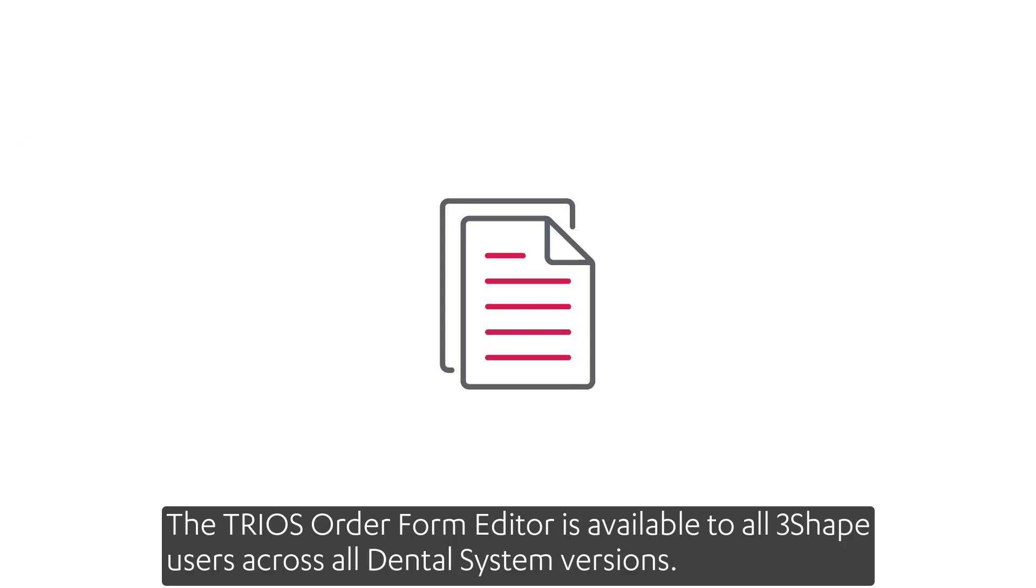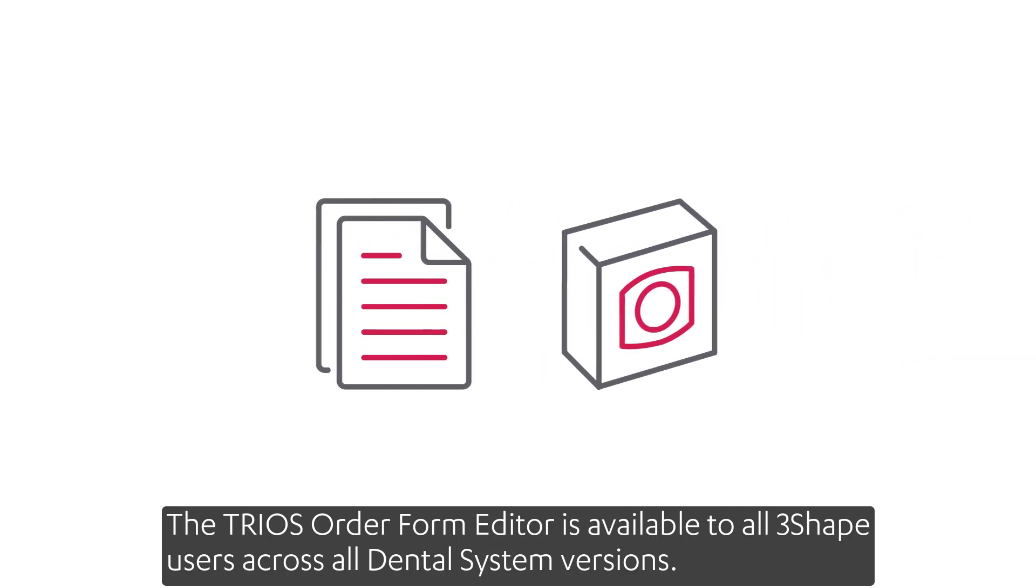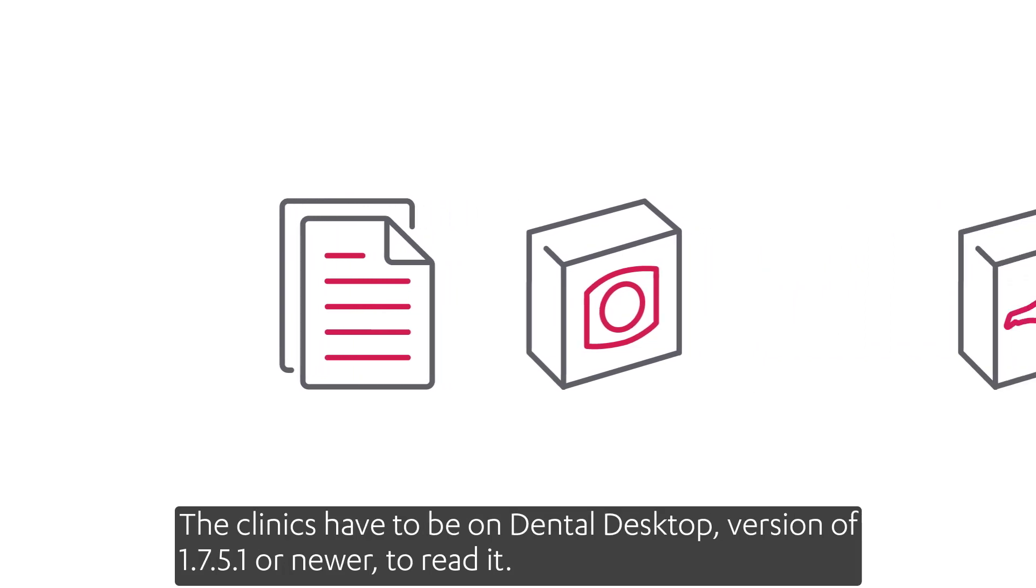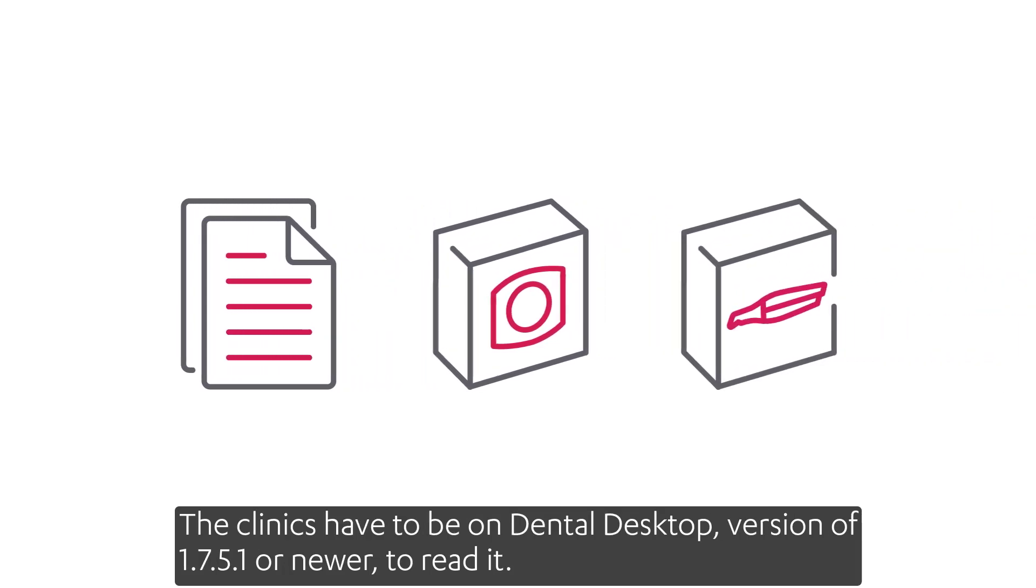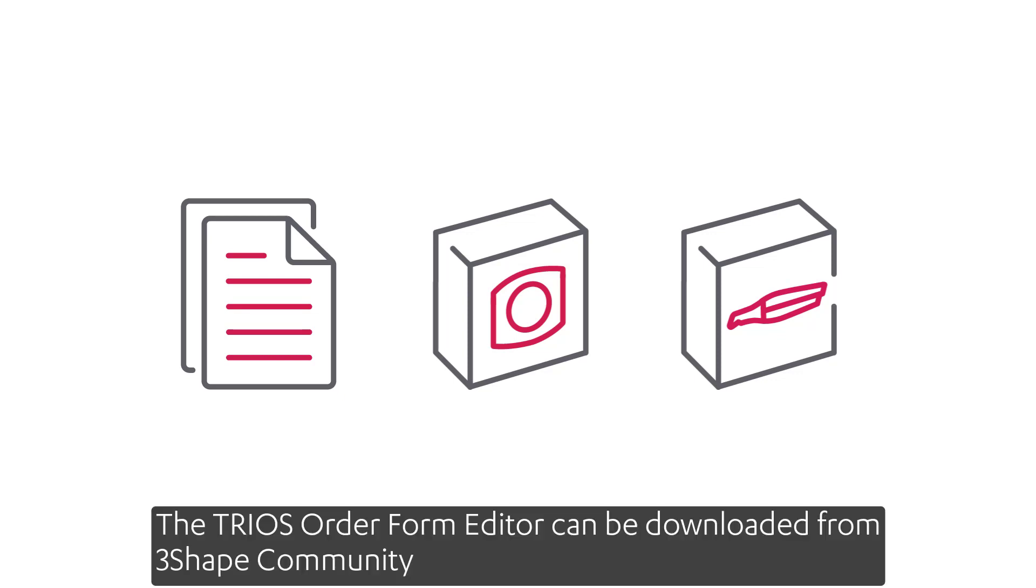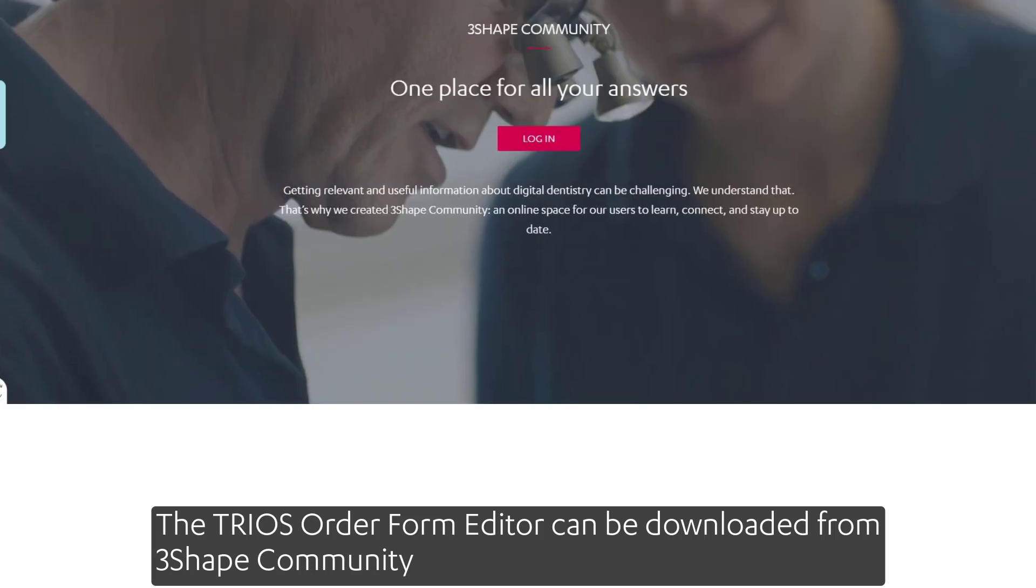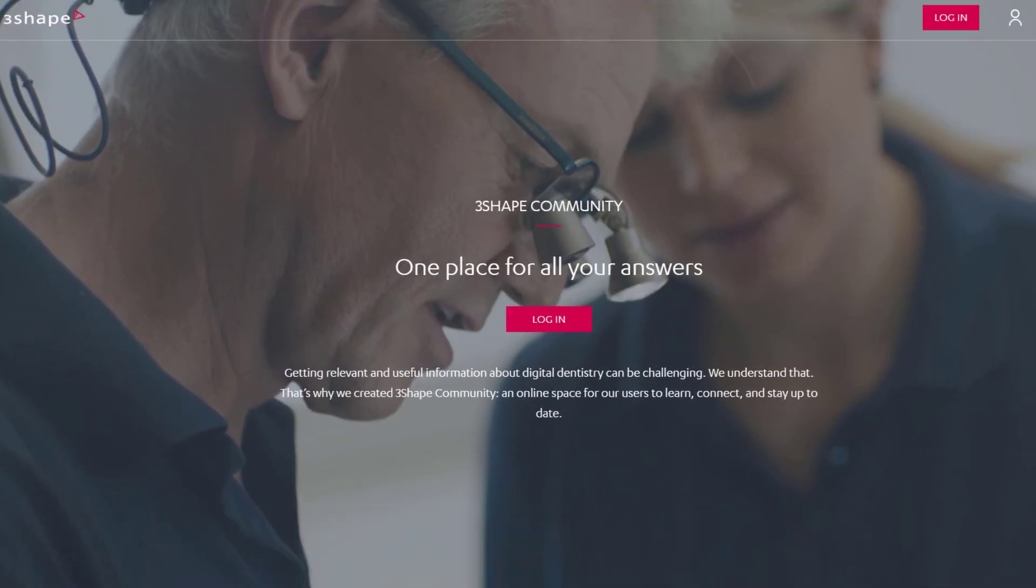The TRIOS Order Form Editor is available to all 3Shape users across all Dental System versions. The clinics have to be on Dental Desktop version 1.7.0.5.1 or newer to read it. The TRIOS order form editor can be downloaded from 3Shape community.